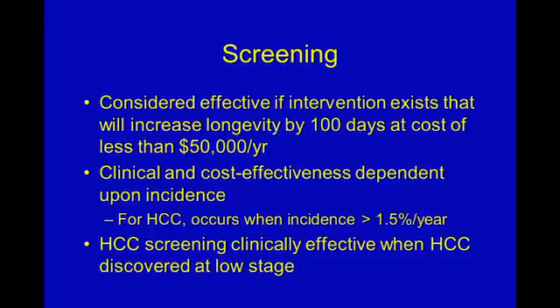So how do we detect these earlier? Well, the answer is screening, and ultrasound is actually the vehicle for screening worldwide. And screening is considered effective if the intervention that's performed will increase longevity by 100 days at a cost of less than $50,000 a year.